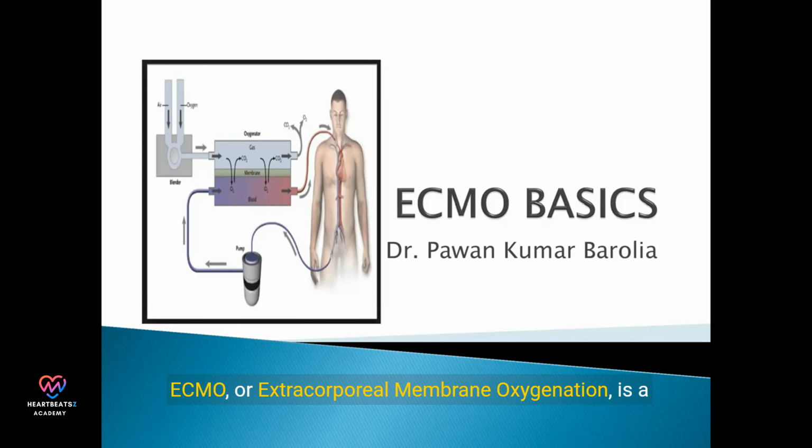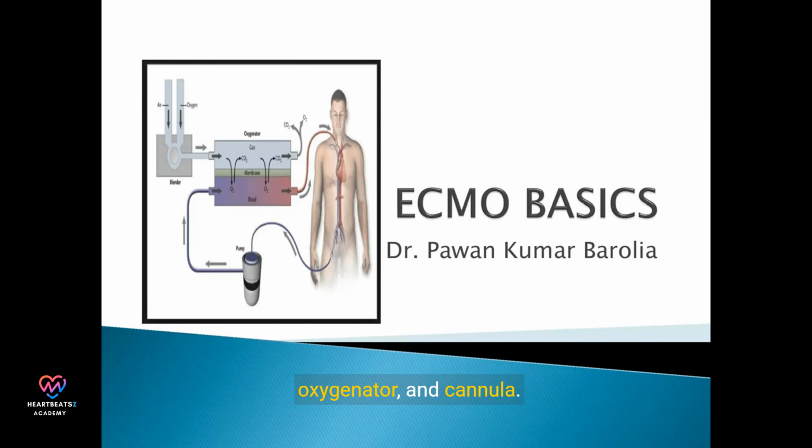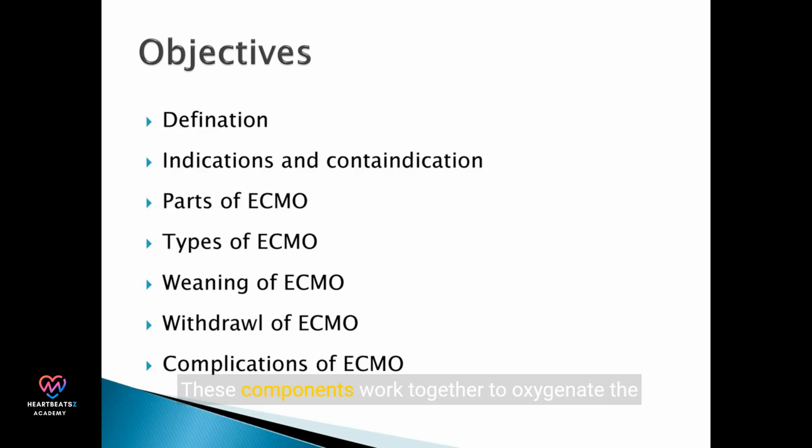ECMO, or extracorporeal membrane oxygenation, is a life-saving technique used in critical care. It provides cardiac and respiratory support to patients whose heart and lungs are unable to function properly. The main components of ECMO include the pump, oxygenator, and cannula. These components work together to oxygenate the blood and remove carbon dioxide.